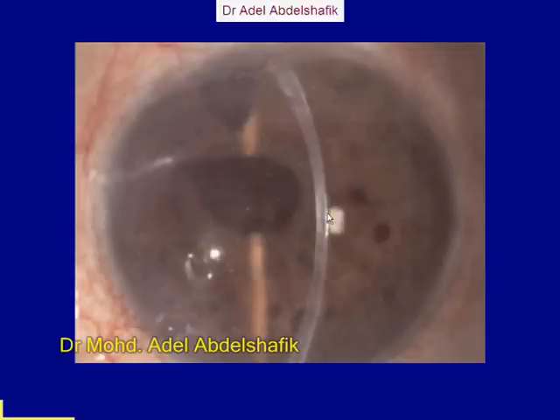To tell that the cornea is thick, you can do one of two things. Either compare between the center and the periphery, or, if the cornea as a whole from the center to the periphery is all thick, then compare one eye to the second eye. So this hazy cornea most probably could be due to some edema.